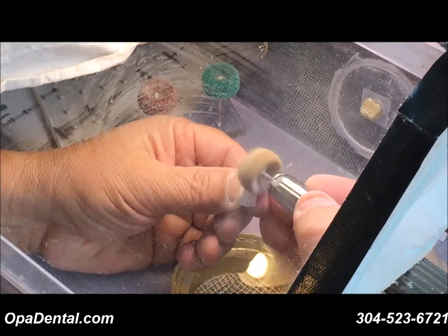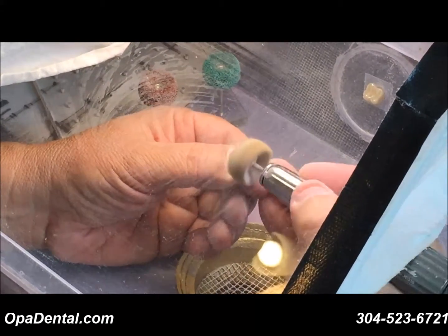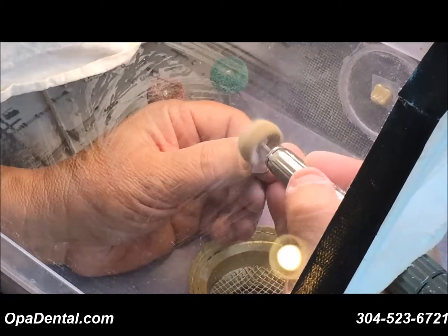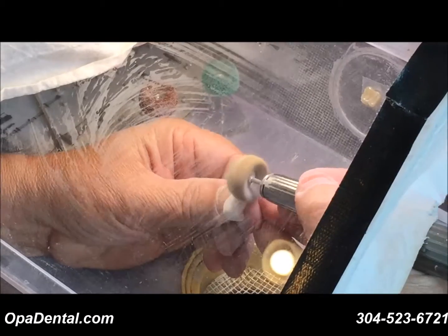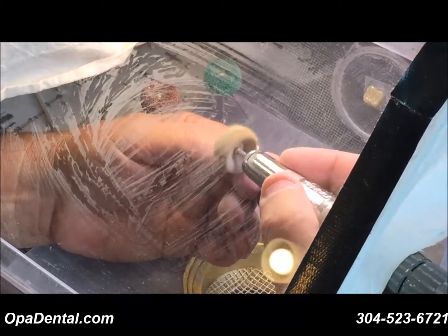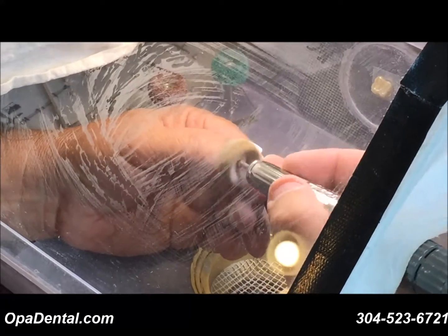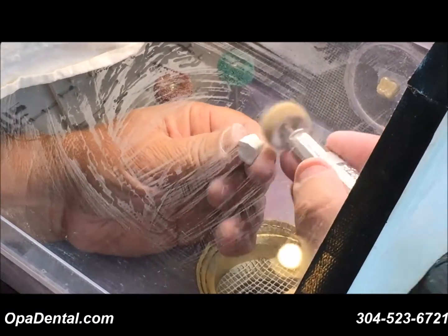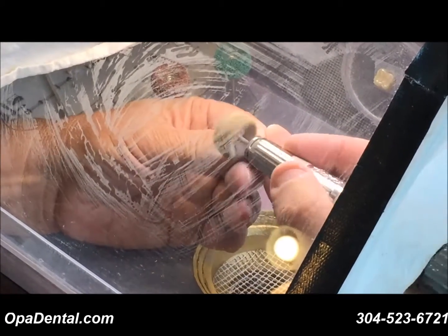I'll go ahead and get started. The nice thing is they're pre-mounted, so you don't have to worry about getting them mounted centered because they are a brush. They're very easy to control. I can go right up to the margin and not worry about wiping the margin out. They're very fast, which is also important. And of course, the price is right. The whole idea is to increase our margins so we can make a few dollars as a lab technician or owner.